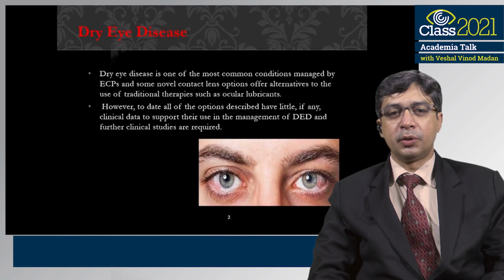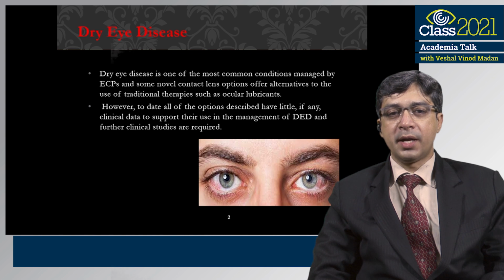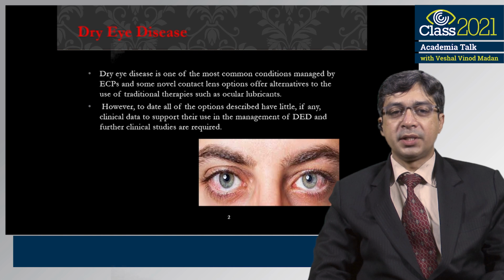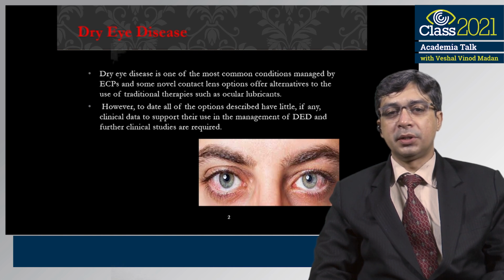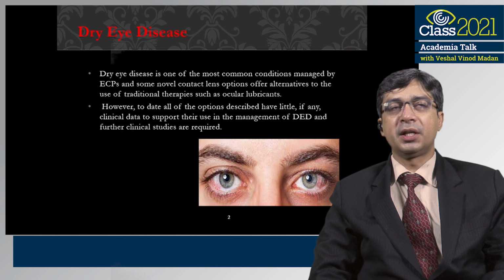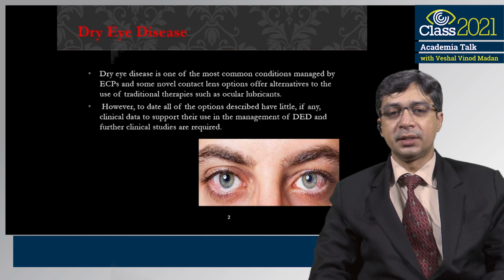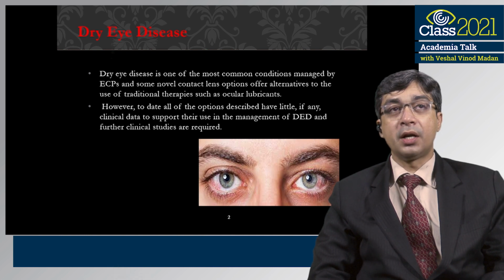Well, everybody knows about dry eye and the condition it causes. Dry eye disease is the most common condition managed by contact lens practitioners, and some novel contact lens options are offered as an alternative to the traditional methods and therapies of ocular lubricants. However, to date, there is little, if any, clinical data to support the use of these options in the management of dry eye disease, and further clinical studies are still required.